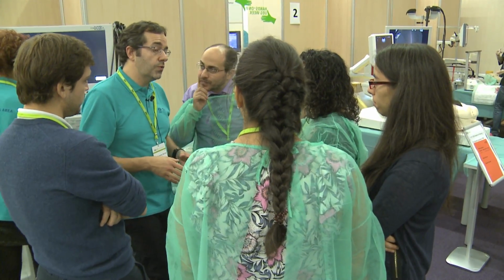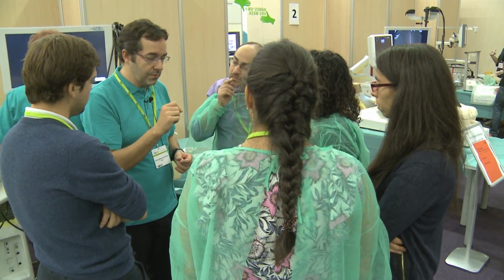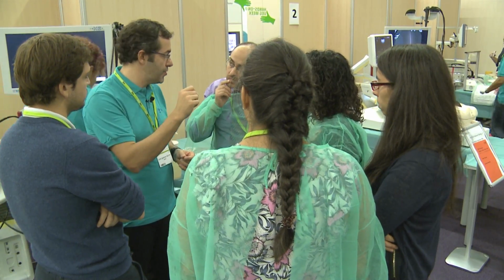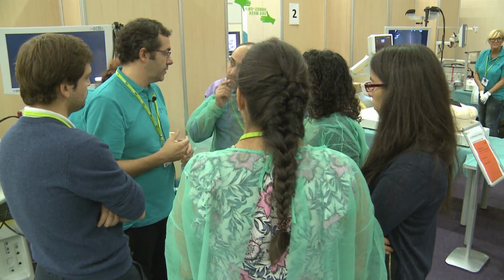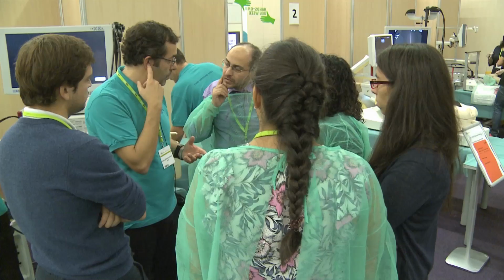Because what the surgeons really want from us is just to place some ink, tinta china, to mark the lesion and leave it. They will remove it. Mark what? The lesion in the stomach.